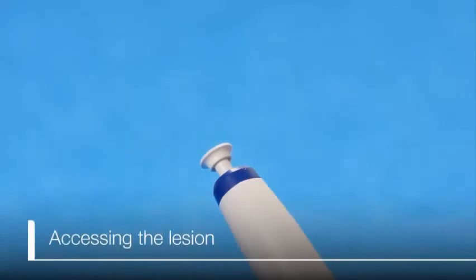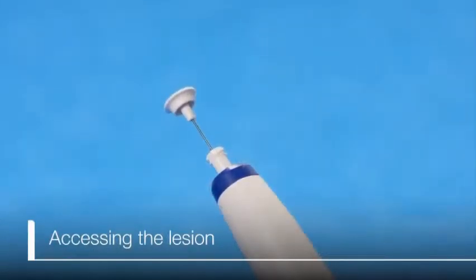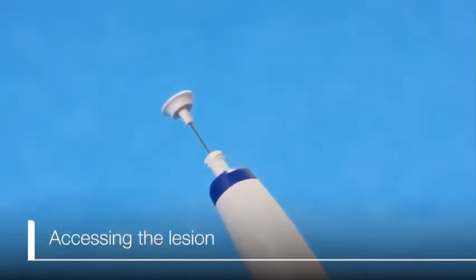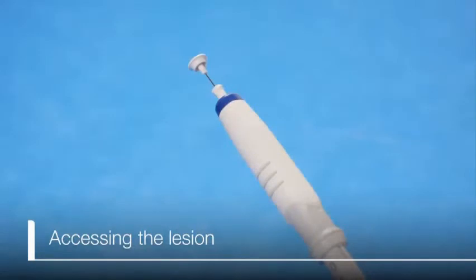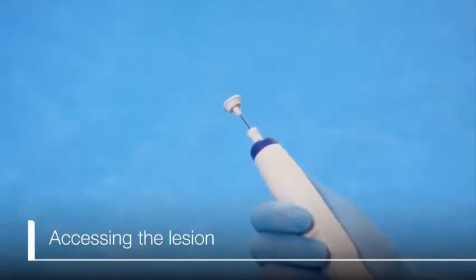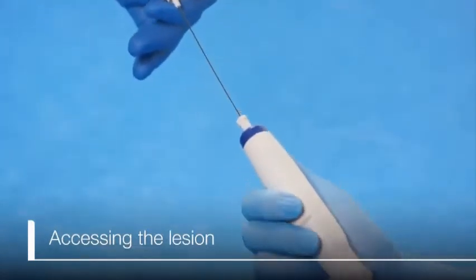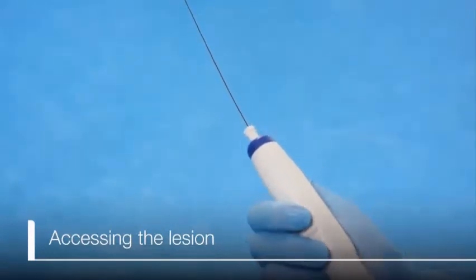Once the sheath is at the desired site for sampling, the physician will pull back the stylet to sharpen the needle. Then the physician will make the first puncture into the lesion. The physician will push the needle within the lesion to acquire tissue, which may be done either by slowly pulling up the stylet, which will drag tissue into the needle, or with suction by the provided syringe.